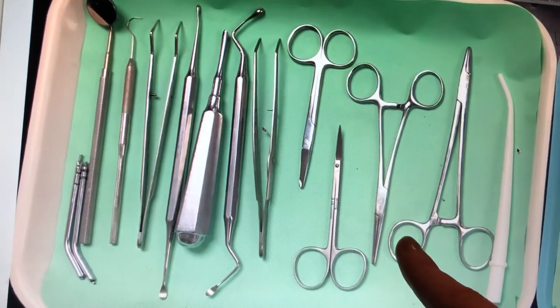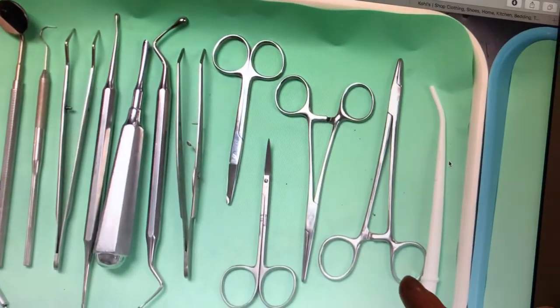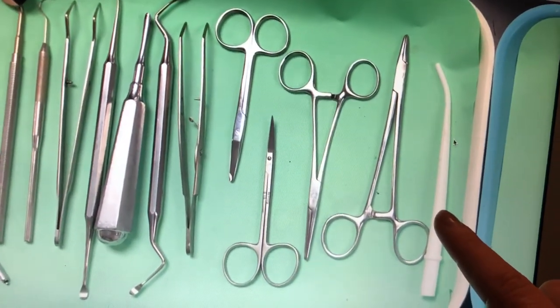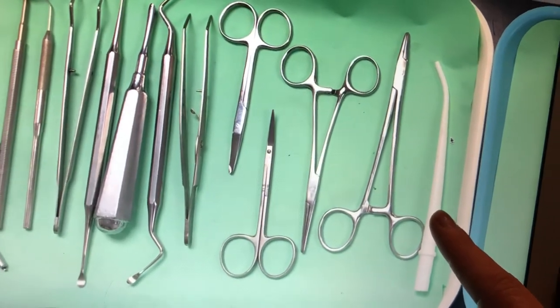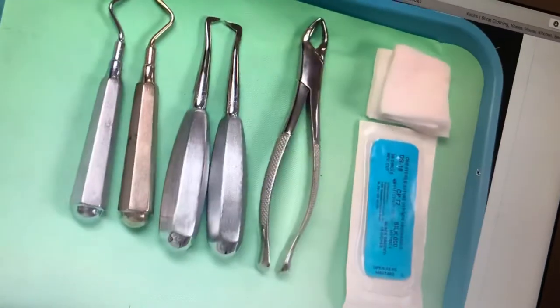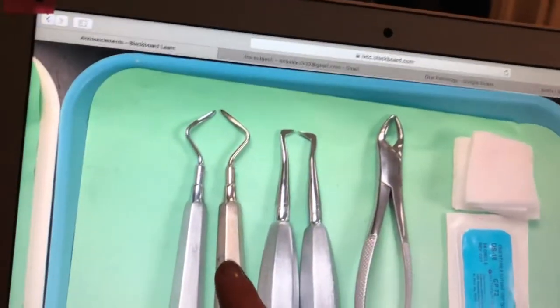This is the surgical needle holder, so that's what we're going to use to hold the needle to string the stitching up. Then this is the high-volume surgical evacuation tip, which is going to be used just like the saliva ejector or HV — it's used to suck up blood, saliva, or other debris in the mouth.